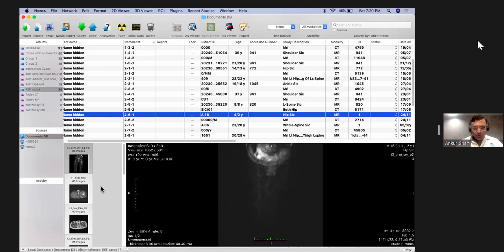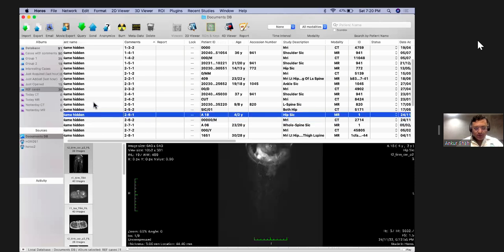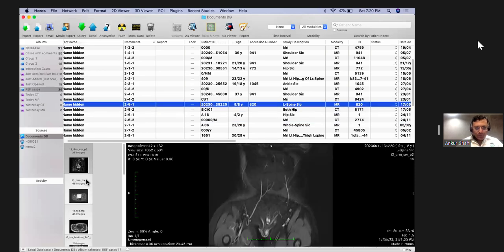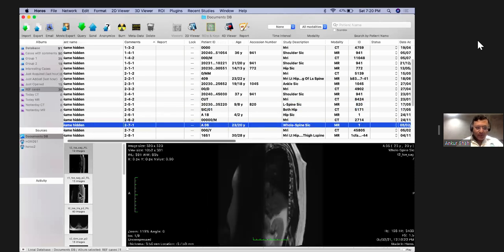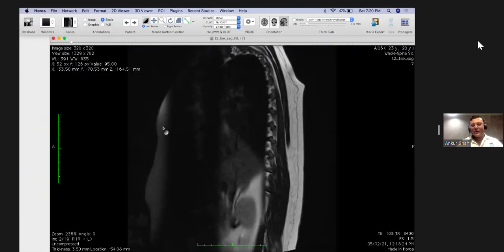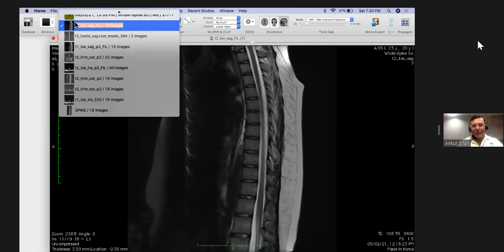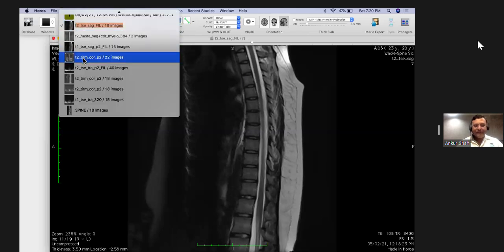I can just show you a few more of those, but I'll show you just one, which is more important, possibly, when a patient presents with back pain or leg pain, and again, whenever a young individual, when we get an MR spine, you do not find anything abnormal on the T2 weighted images or on the routine MR images.